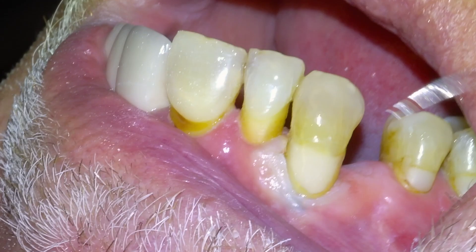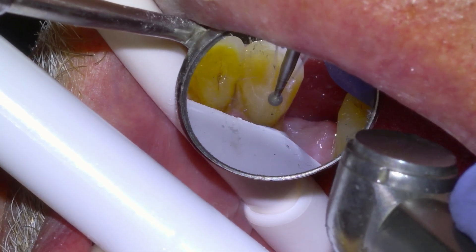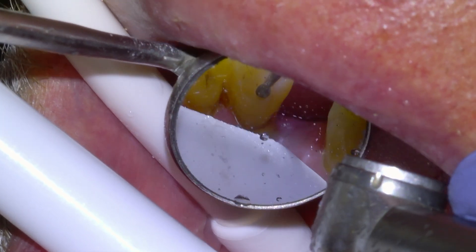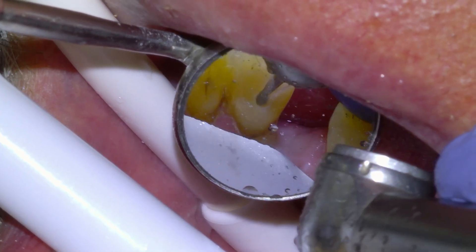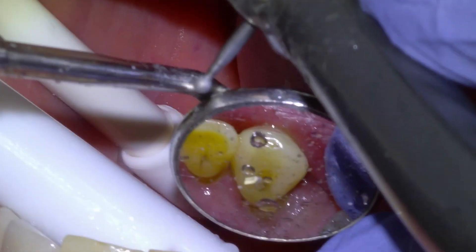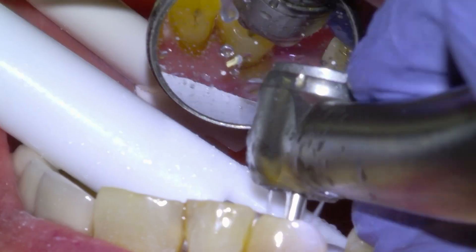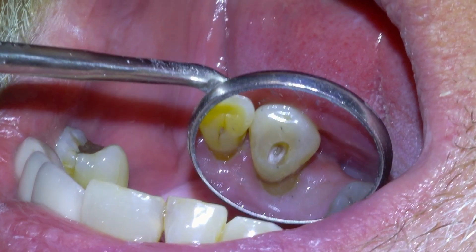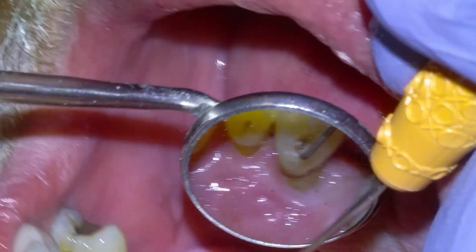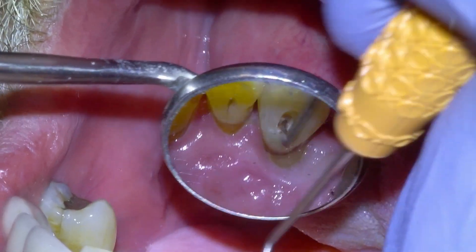I always do root canal access without a rubber dam so that I can visualize the axis of the tooth. We're just going to start by accessing the pulp chamber from the lingual surface with a high-speed handpiece and a round diamond, going down a few millimeters until we can see that we've unroofed the pulp chamber. We'll verify with our explorer and we get a good stick, so at this point we're going to put a rubber dam on.